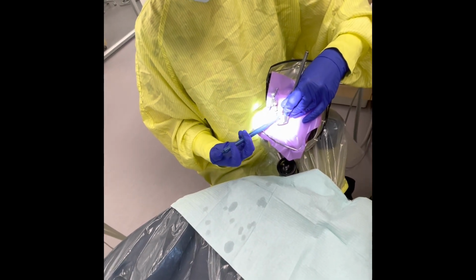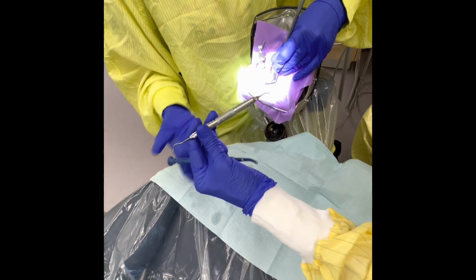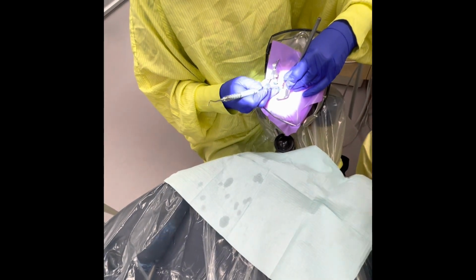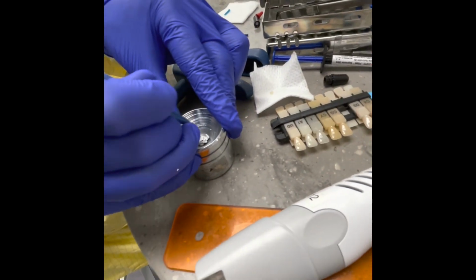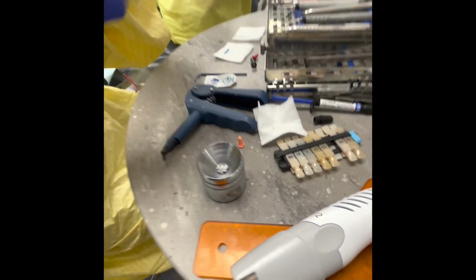And the first instrument I'm going to pass her will be a condenser, and this can be a stainless steel instrument. There you go. Thank you. And would you like another carry? I would love another one, please. Thank you. So I'm going to come back, get a little bit more amalgam. Typically, there will be at least 2 carries that are needed of amalgam. Come back in.